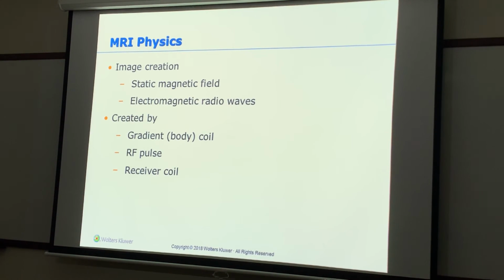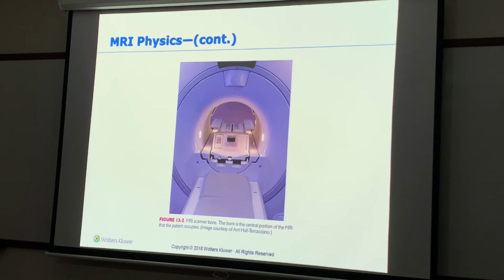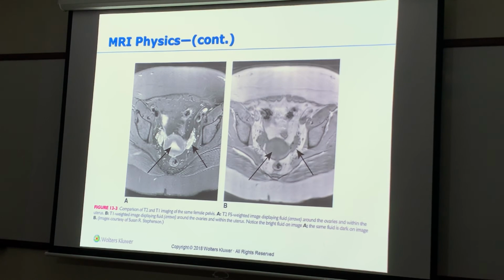Okay, so what else can I tell you? A CT machine looks just like an MRI machine. The only difference is the coils. MRI uses electromagnetic waves. And what does CT use? It uses radiation.